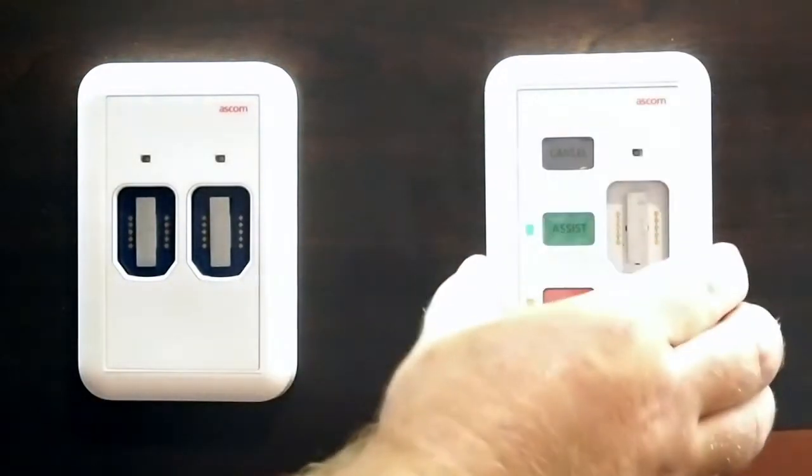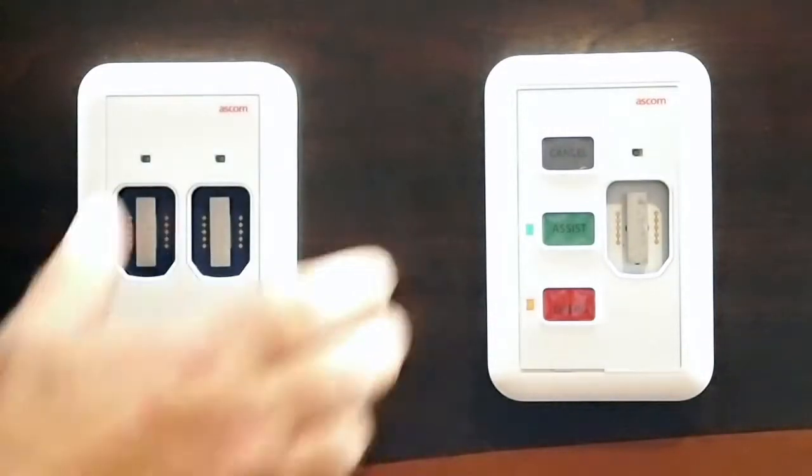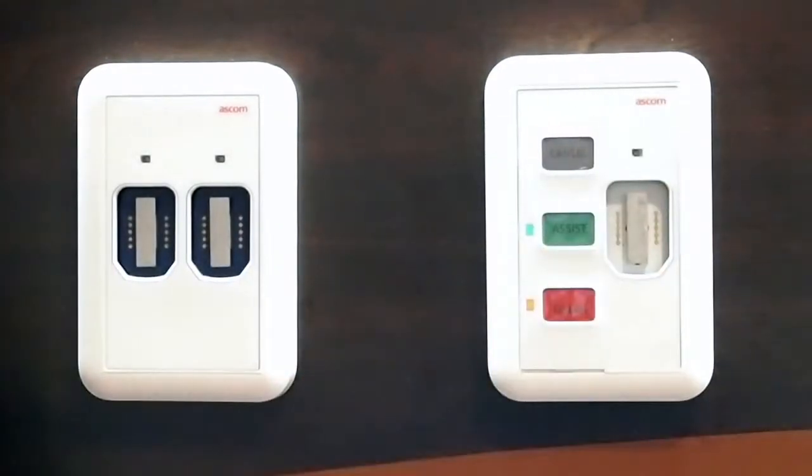This can stand alone as shown here, or it can be paired with other devices. We have a host of devices that can be mounted in separate back boxes as shown here, or they can be stacked up within a single back box.